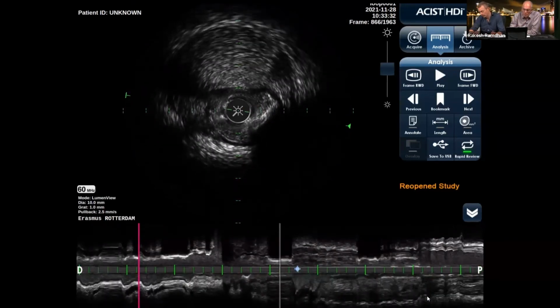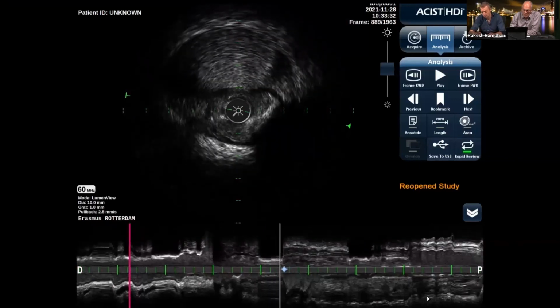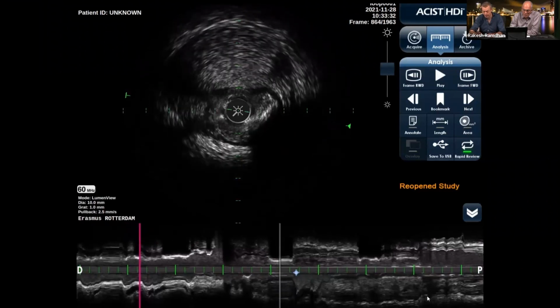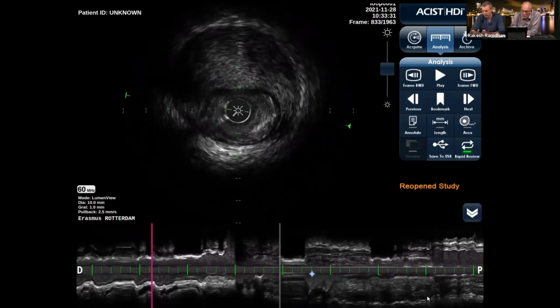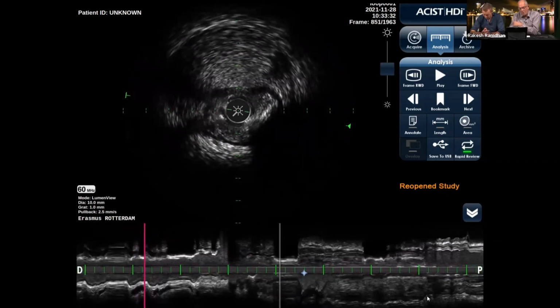Yeah. Or finally, it could be, let's say, originated from an iatrogenic dissection or a catheter that jumped into the roof of a coronary and thereby ruptured the intima of the media and thereby created the hematoma. So that said, this indeed is a large hematoma, but also underlying plaque. So this had to be treated.